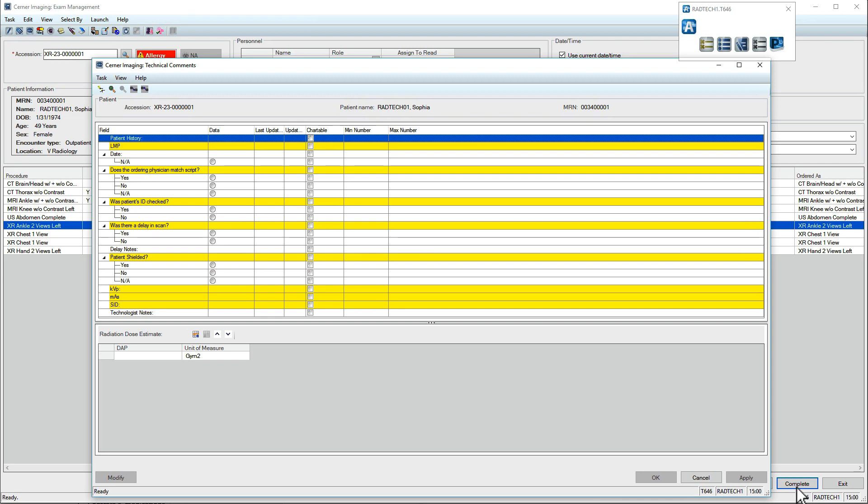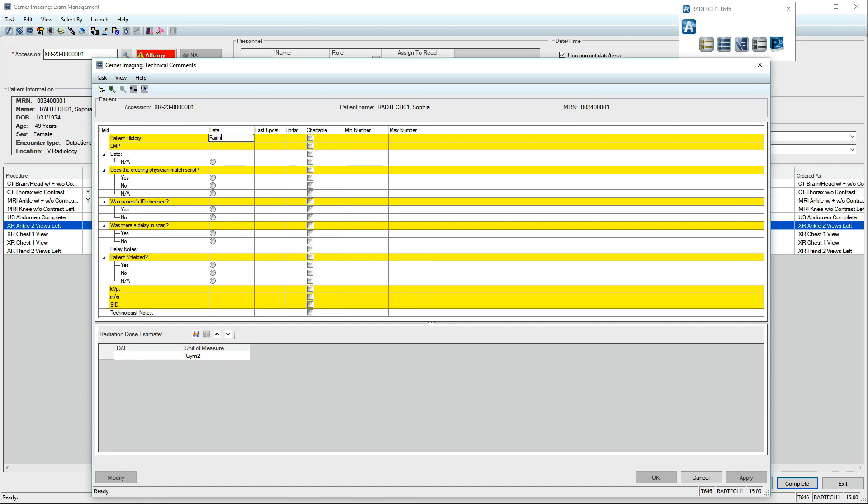Windows will automatically open depending on the type of exam ordered. This is the Technical Comments window. Document the patient's history and answer all questions by double-clicking your selection.